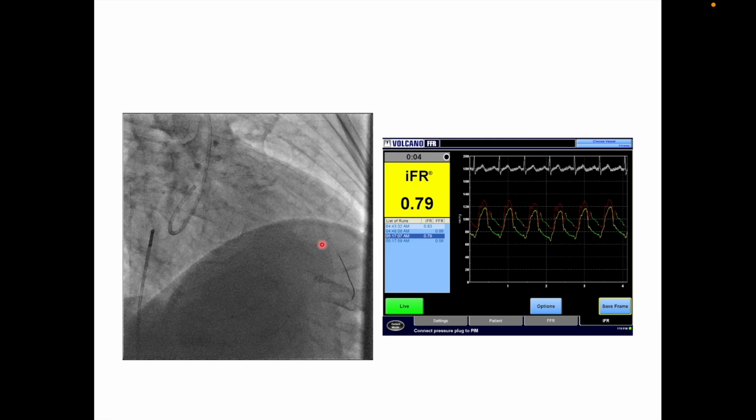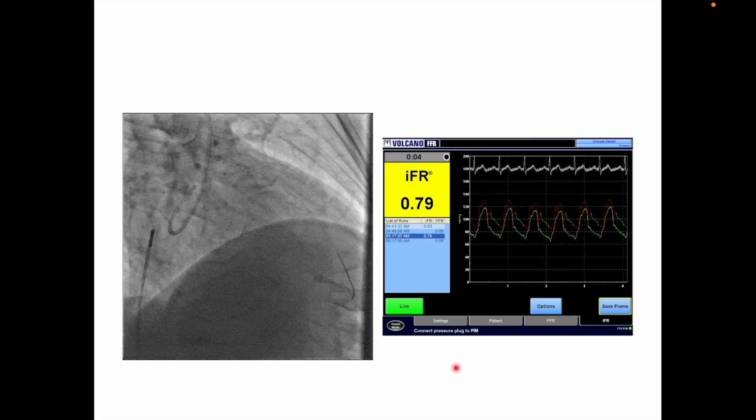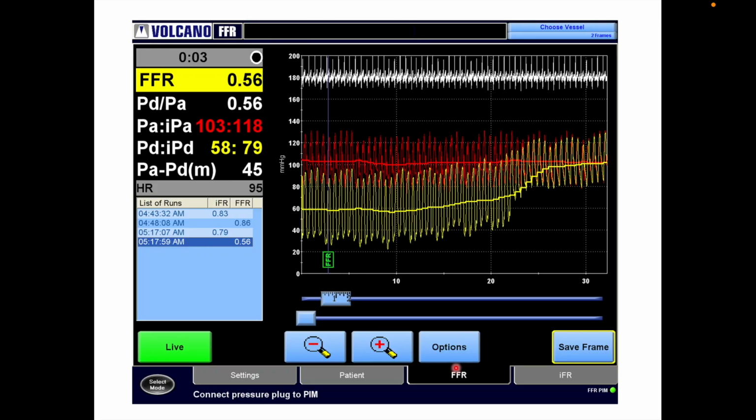And this is the cumulative FFR of the distal left main and the whole of the LAD. Now, we did an FFR as well, and it came out to be 0.56, highly significant. And if you look at the pressure tracing, now you can well appreciate that there is a focal step up in this. Although I thought LAD might prove to be diffuse disease, there is a significant step up, and this significant step up came right at the ostium of the LAD and the distal left main stem. That's the area where we had this big focal step up.